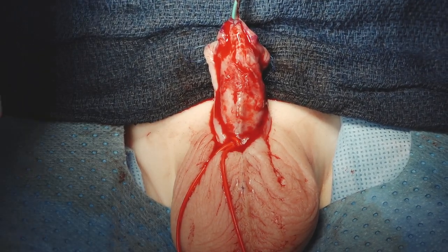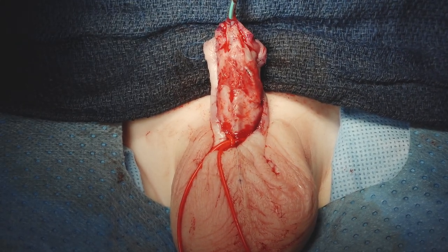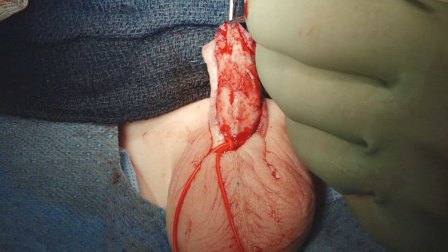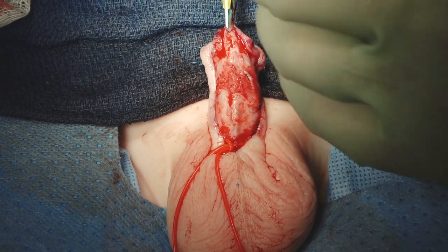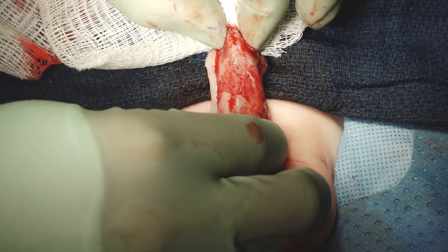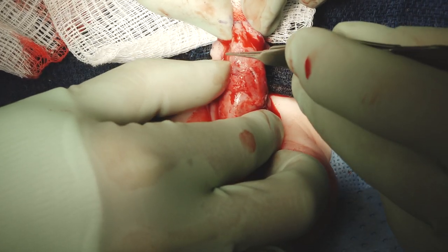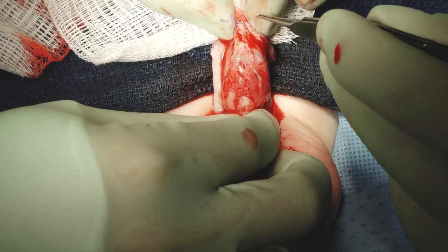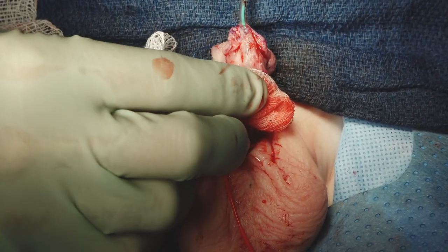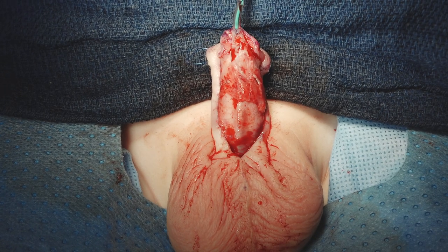There are our two layers of epithelial closure. We've started doing something we've never filmed — putting in an angio catheter after we do it and just pressurizing that with some fluid to check. We've started doing that on proximal ones but can do it on all of them now. You'll see some fluid come out of vessels, but there's no leak. Sometimes there is, and then you realize you need another stitch right there. We think that's a good habit to have — just to check.